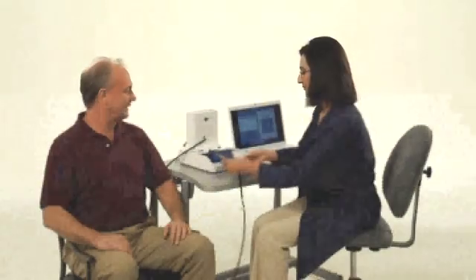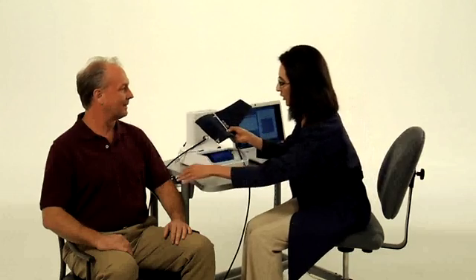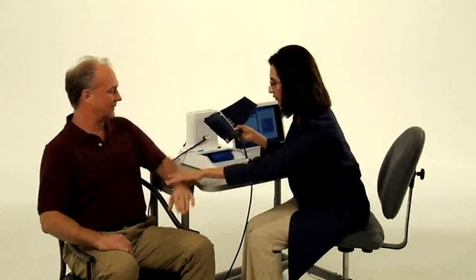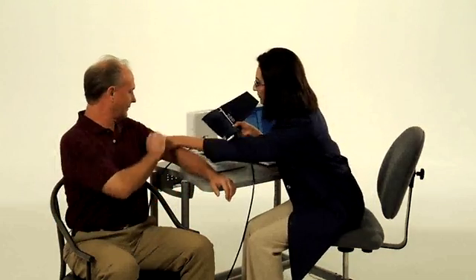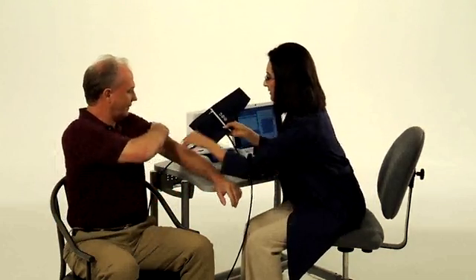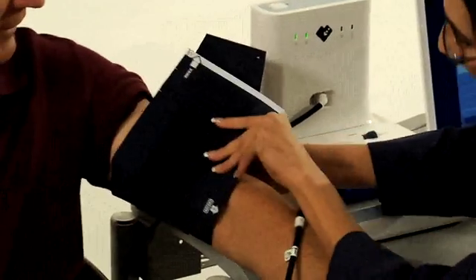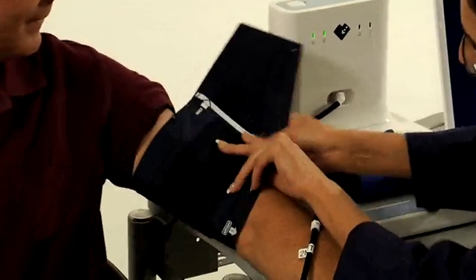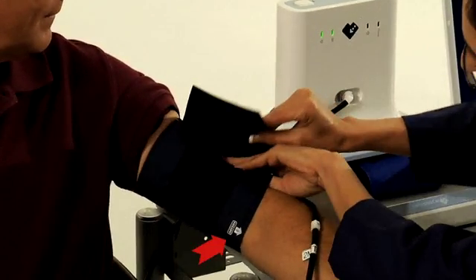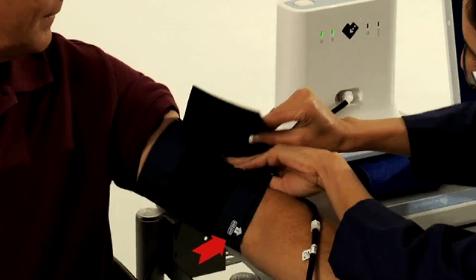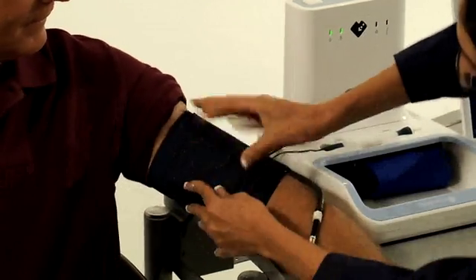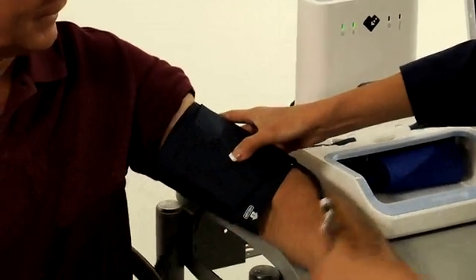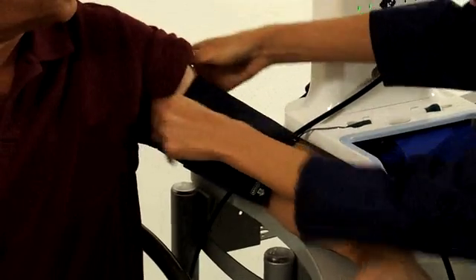Fit the brachial cuff on the patient's arm. The arm with the cuff should be supported, placed at the level of the heart. When placing the cuff on the patient's arm, make sure the artery mark is over the brachial artery. The cuff should always be placed against the skin, never over clothing.